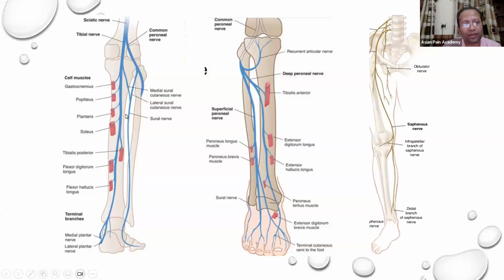If I see now the anterior side, then you can see that the peroneal nerve, after coming to the anterior side from the fibular neck, is giving multiple branches. Okay, so there is the deep peroneal nerve and the superficial peroneal nerve. The superficial peroneal nerve will go laterally, and the deep peroneal nerve and anterior tibial nerve are all the same. We will also see this here. So you have understood.